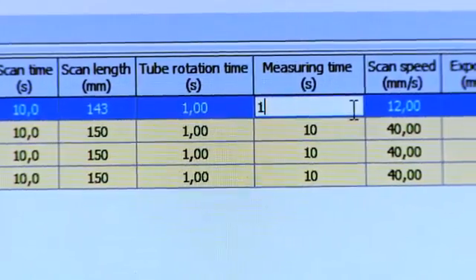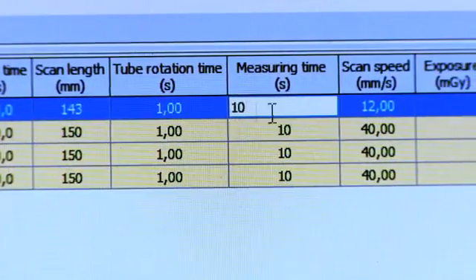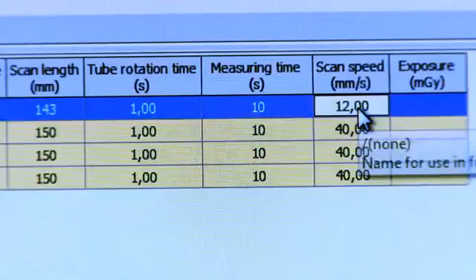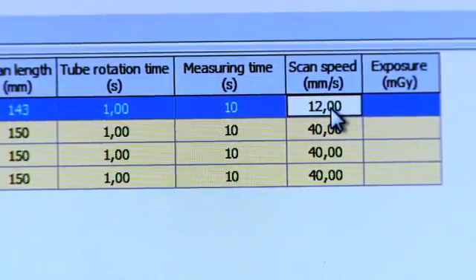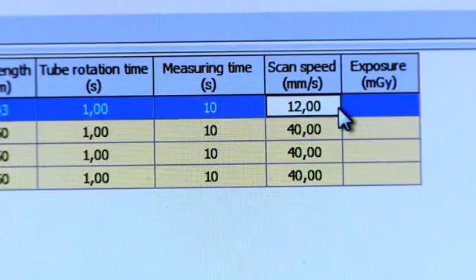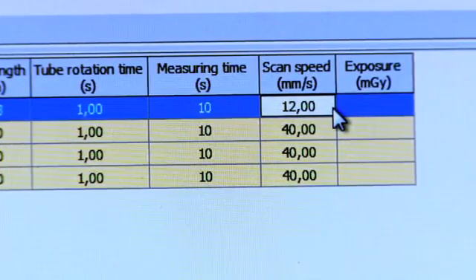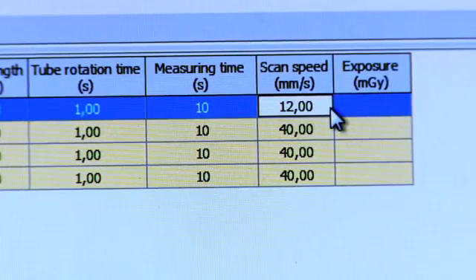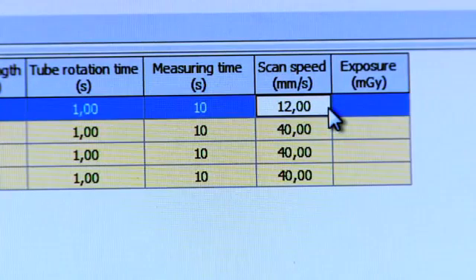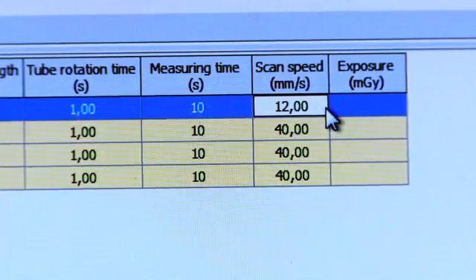Tube rotation time. Measuring time. This is the time it will take Ocean to collect the data from the measurement. This should cover the scan time. It is a good idea to choose parameters that shorten the scan time, for example, by selecting a higher pitch. When all parameters have been added, Ocean will automatically calculate the scan speed.